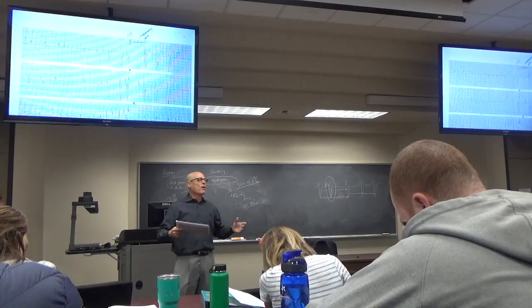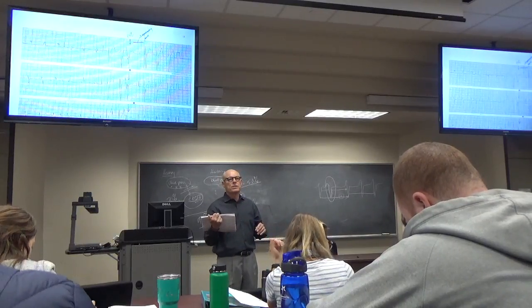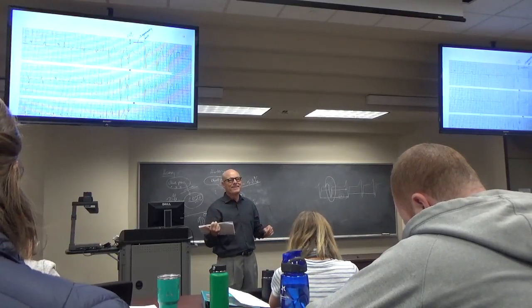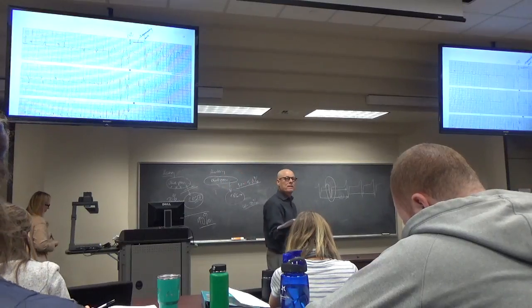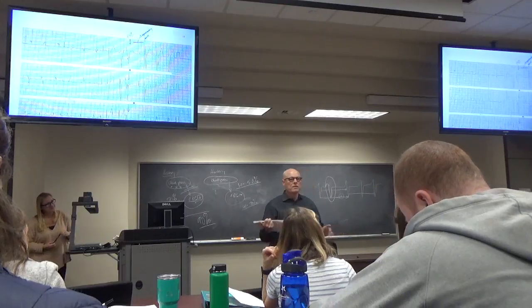0.52, that's really long. Was this what I was talking about? Just look at your box up there. Yeah, sometimes I forget what I'm writing, but I put left anterior fascicular block. Yeah, we're not going to talk about fascicular blocks.